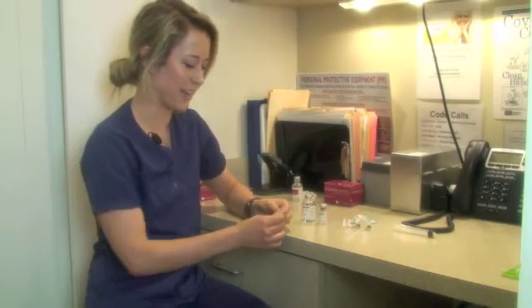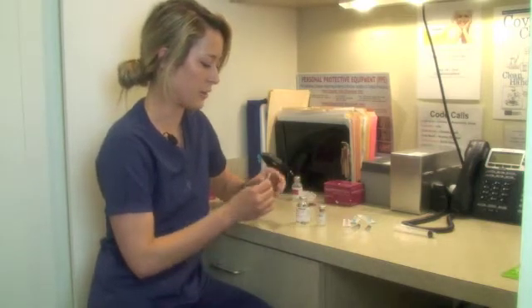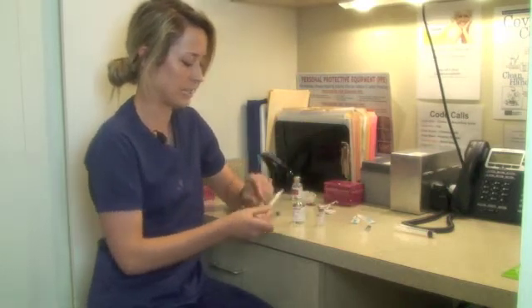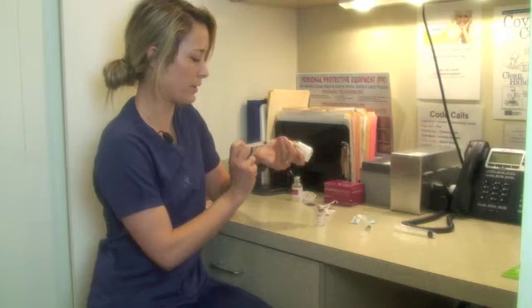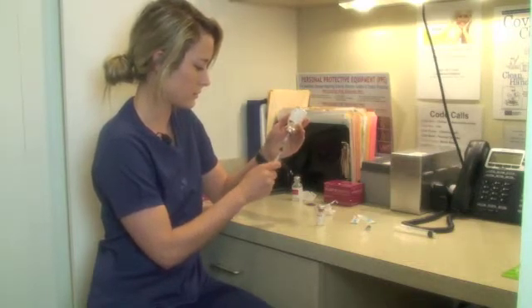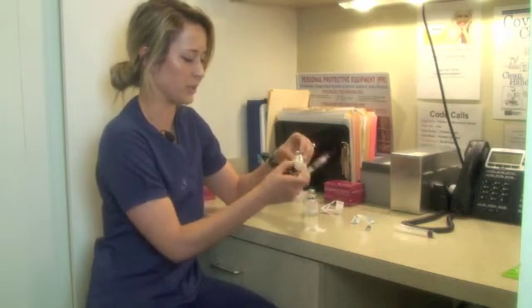So now we're going to learn how to mix the Sculptra. This vial has been sitting for one week, so it's ready for use. You'll need to get some lidocaine with Epi. Then you're going to take your alcohol swab and sanitize both of the tops. We use 3 cc syringes and an 18 gauge. From here you would draw up 1.5 cc of lido with Epi. And you want to agitate the product, because you want to make sure you get all the product mixed really well.